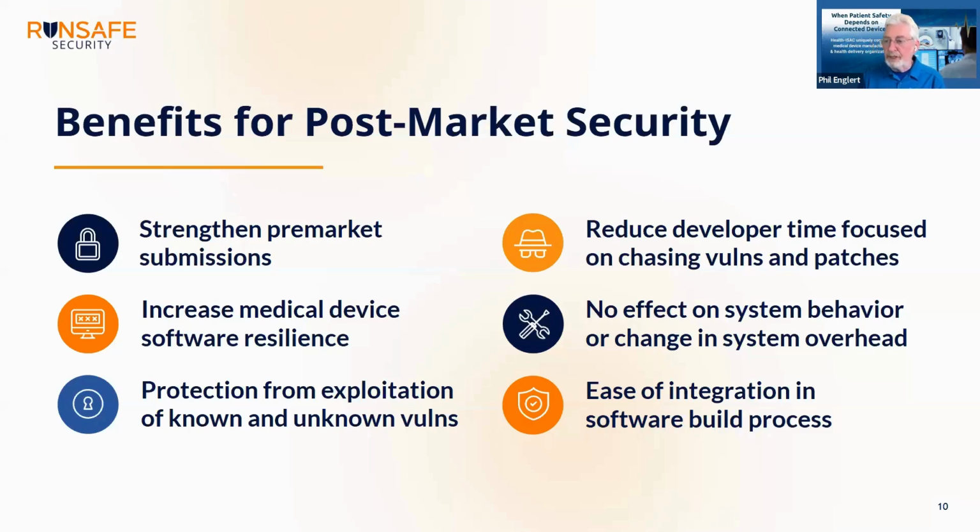I work with the cyber update and patching work group with the Health Sector Coordinating Council, and one of the concerns raised on the HDO side is: what happens when patches don't work? Is there a rollback? Can we reestablish device functionality if a patch has failed? It sounds like having proactive measures reduces the need to patch, so it reduces the opportunity for failure. It reduces the level of investment needed in resources to locate the devices, apply the patch, and test the device after the fact.